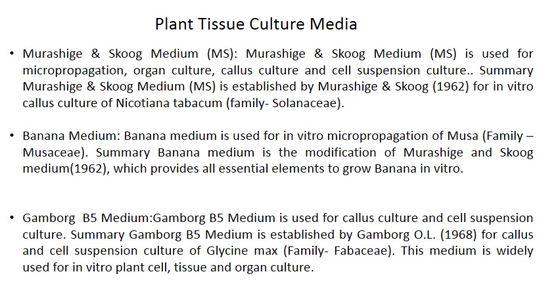Next important media is Gamborg's B5 medium. This is used for callus culture and cell suspension culture.